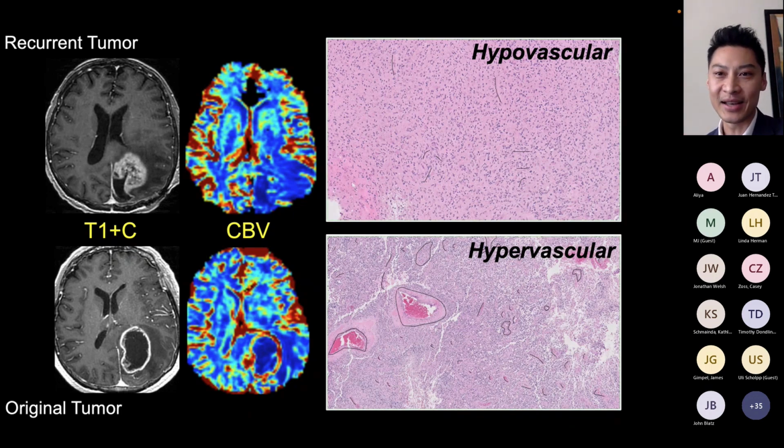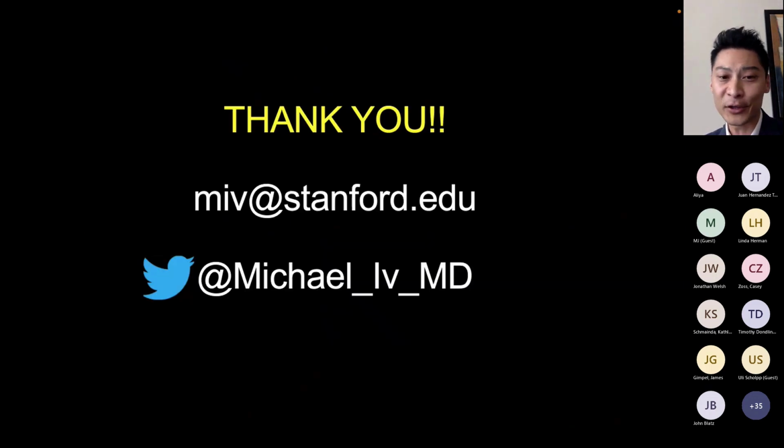And this is just to say that, again, perfusion is not be-all end-all. It's a good guideline to tell you what's going on. And it's a good marker, but it's not always 100% correlated and tied in with tumor proliferation. And that's why there's still ongoing efforts to look at other techniques such as CEST or even PET-MR with amino acid tracers. So thank you for your attention.